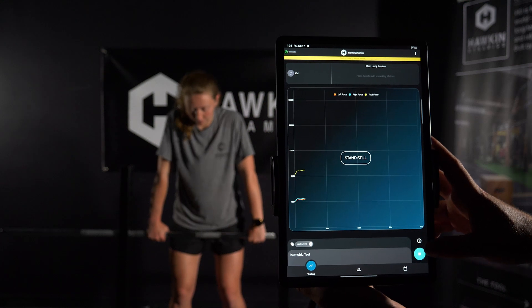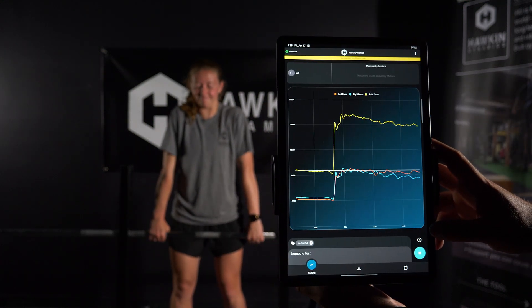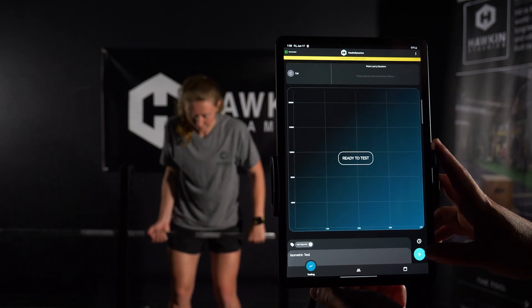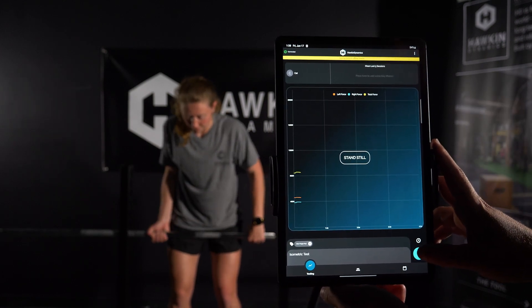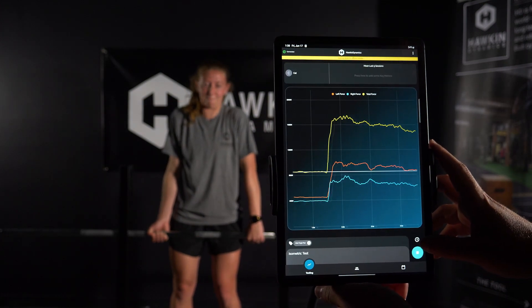The test is now ready to begin. Press the play button on the bottom right of the screen. After the beep and flash, immediately cue the athlete to pull as hard as possible. This pull should last for a period of roughly 4 seconds. The tester should give verbal encouragement during this period.